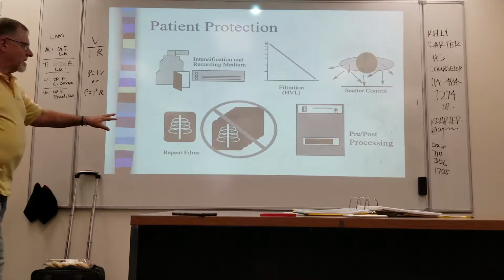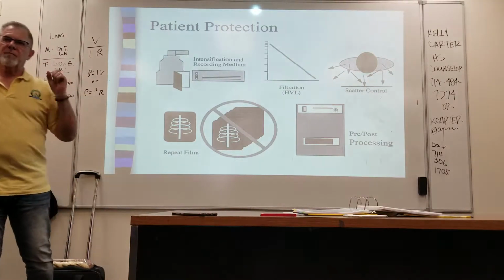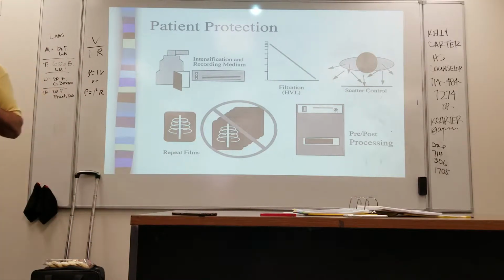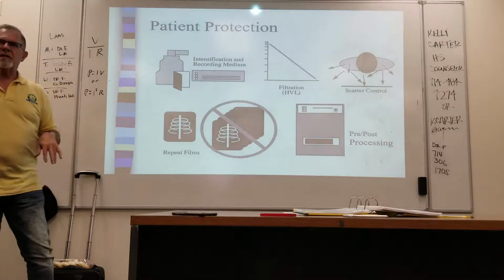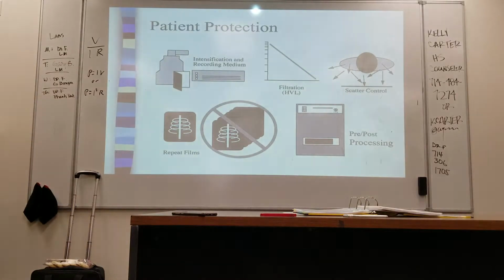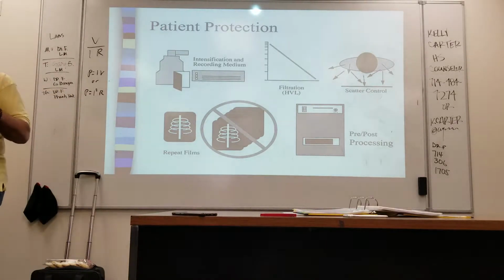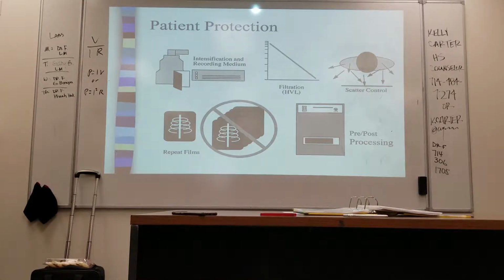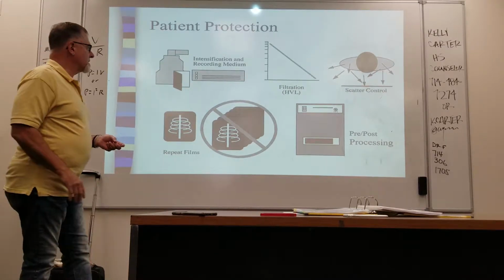And just as a note for you folks, these should never be used as something to beat you across the head with. These are learning experiences. So if there's a chronic issue with a particular room or particular technologist or group of technologists doing repeats, that's a learning experience to try to find out what's the cause. Is it something wrong with the room, or are there some tweaks that you can make in how you're positioning?